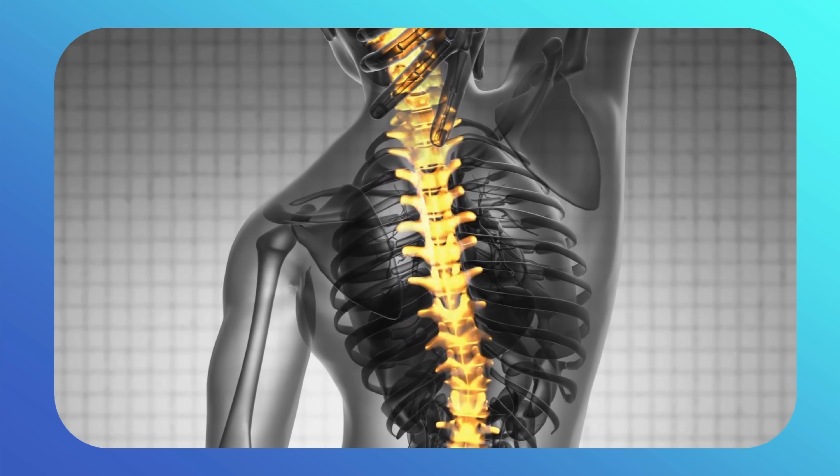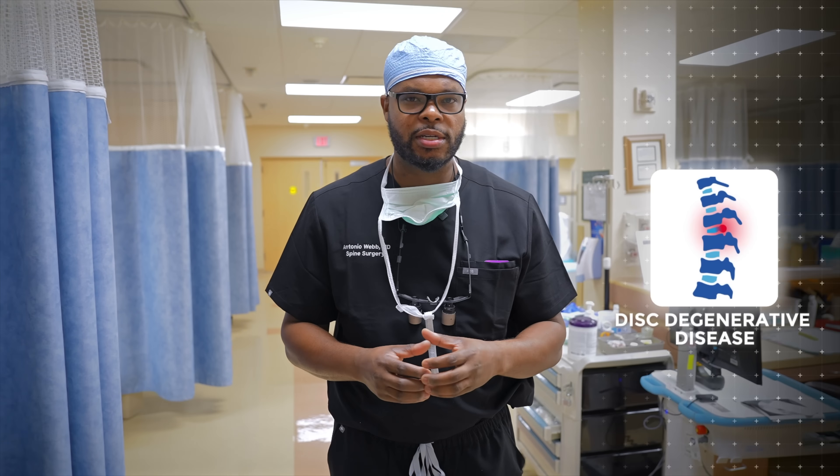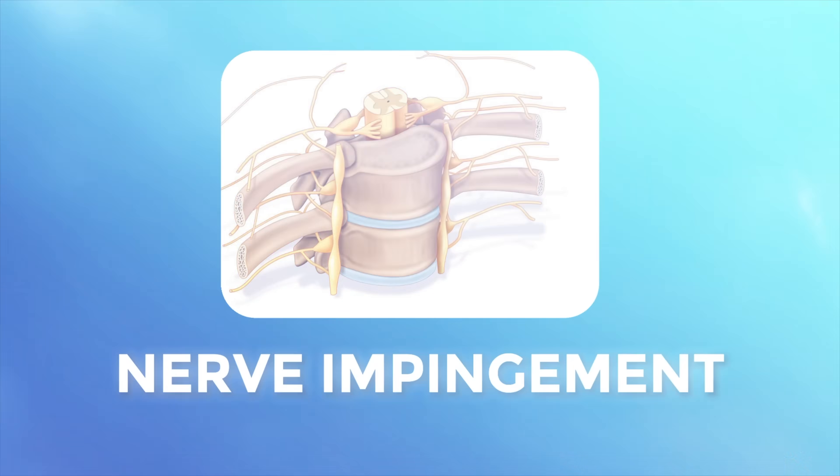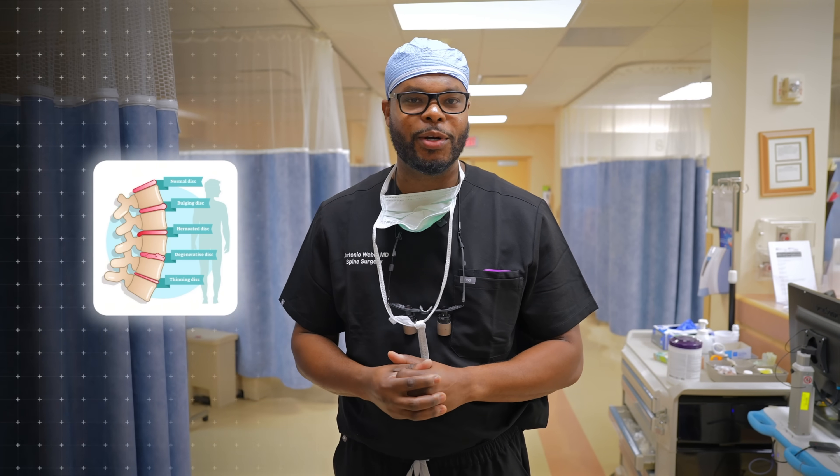This is a procedure that is done to treat conditions relating to the spine such as disc degeneration disease, stenosis — which is tightening of the spinal canal — or nerve impingement. Our patient has severe degeneration of her disc and today we're going to help with that.